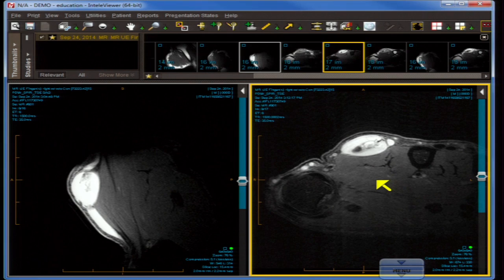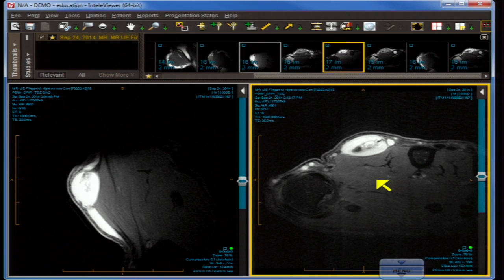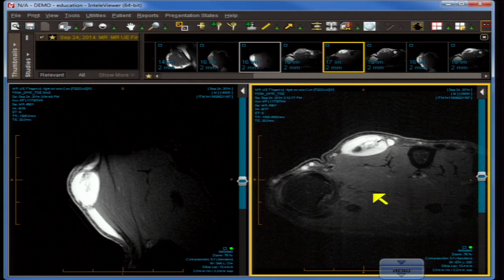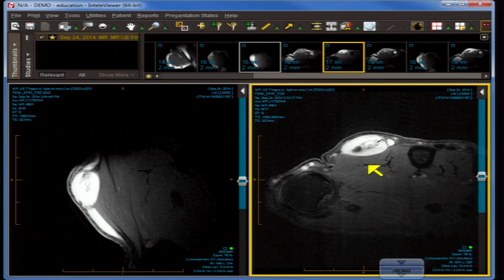The lesion is not just indurated, not just amorphous — it is actually mass-like in character. As for its shape, most of us would agree it's a little bit oval or pear-shaped with two little nipples on each end. Regarding compartment location, it's not in the epidermis, not in the skin, probably not even in the dermis — it's more in the subcutis space but not in the muscular space.